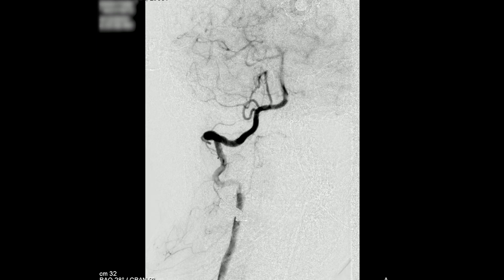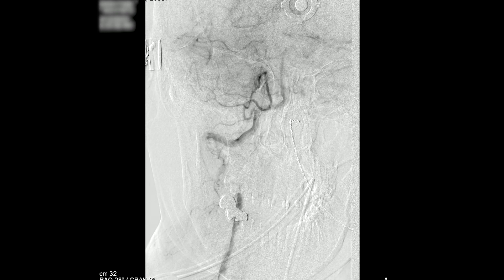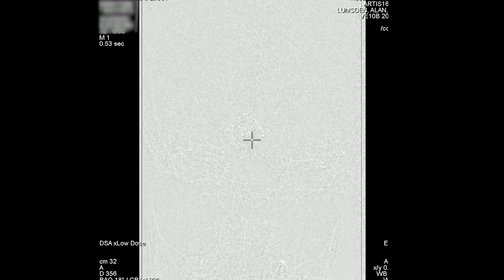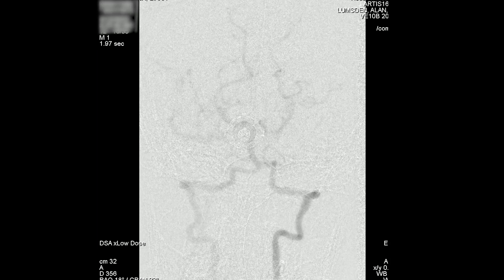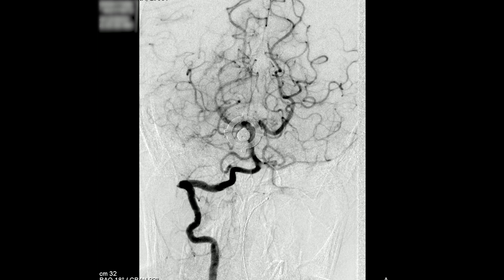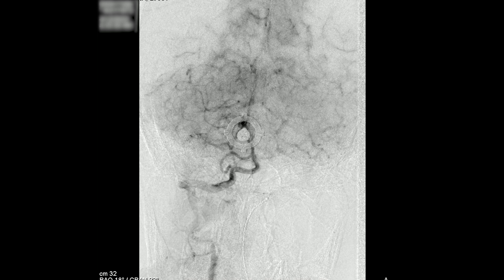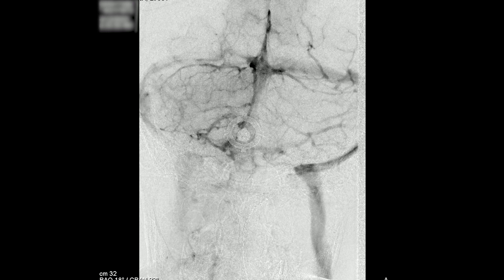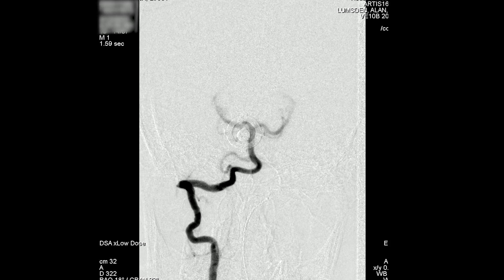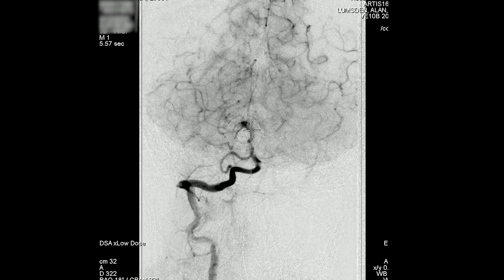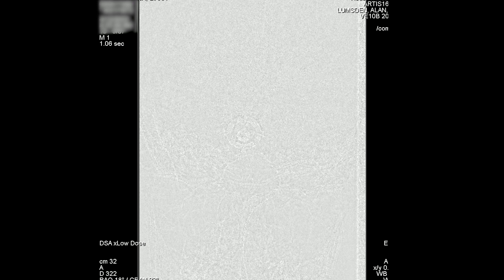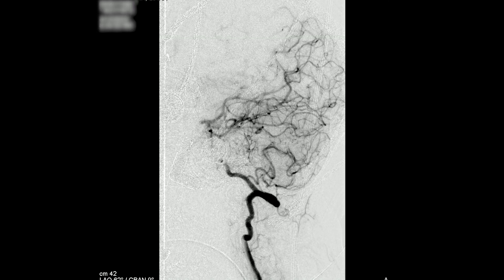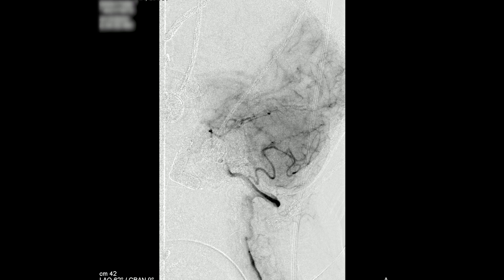Here you can see the termination of the vertebral artery on the lateral view, the basilar artery, and reflux occurring down the contralateral vertebral artery. That's the AP view — obviously you've also got to get a lateral view. We're looking at the PCA, following it through into the sinus views. And that's the Townes view. Next we're going to look at the lateral of the right vertebral artery.